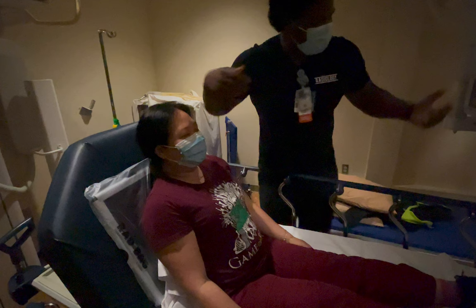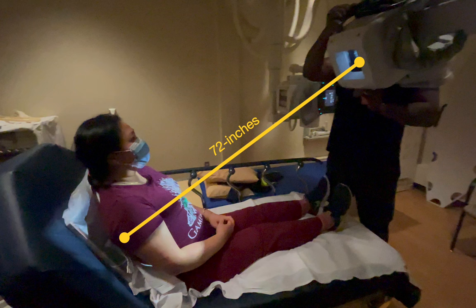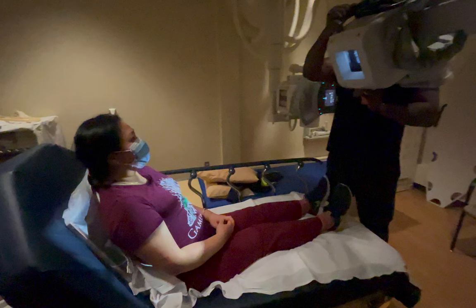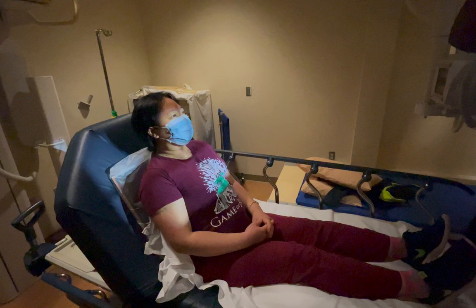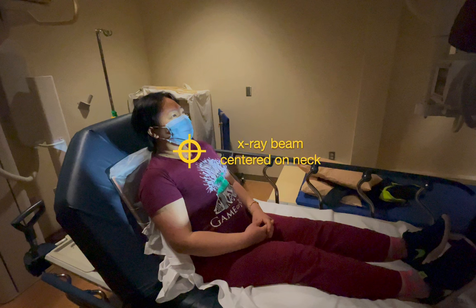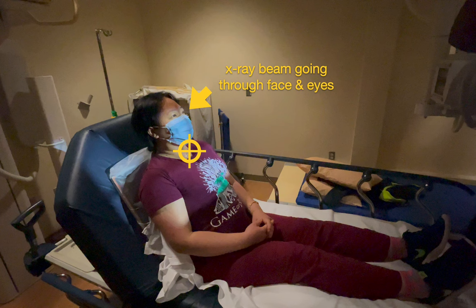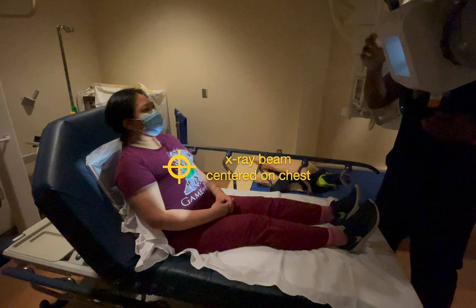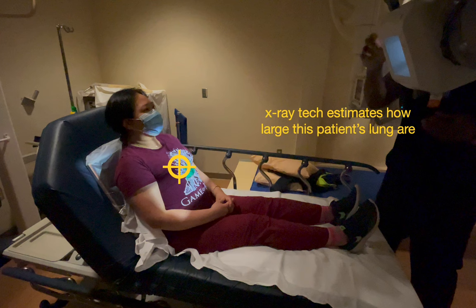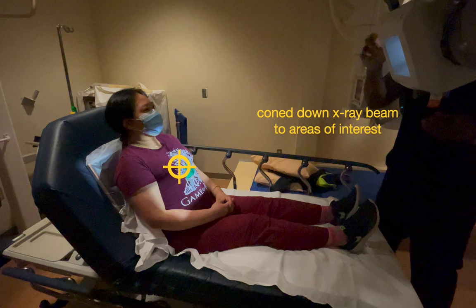Once the x-ray tech is satisfied with the position of the x-ray detector panel, they'll position the x-ray tube so that it's situated 72 inches from the x-ray detector panel. They'll also turn on the visible light beam from the x-ray tube to see where the beam is aimed. If the beam is aimed at the patient's neck and face rather than their chest, the tech will reposition the x-ray tube so that the beam is now centered on the patient's chest.